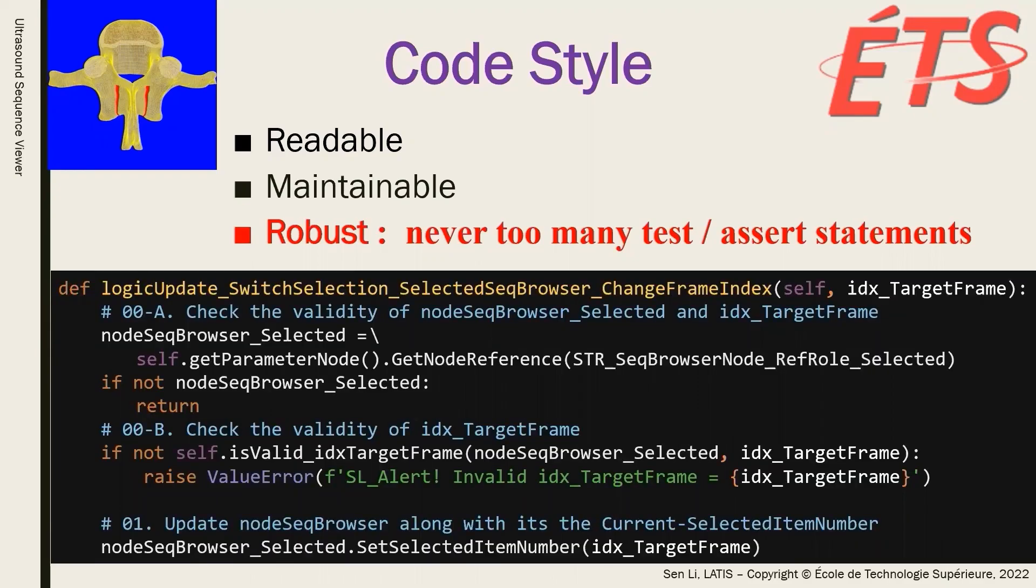This is a back-end update function. It is called when the current active sequence browser needs to change the selected item number. In our application, we can not only switch between different sequence browsers, but also switch between different 2D images, both within a sequence browser and across different sequence browsers.